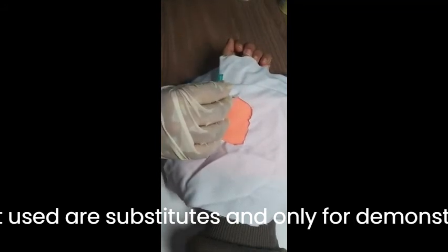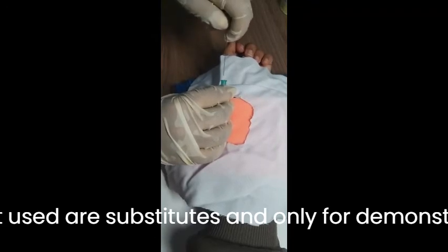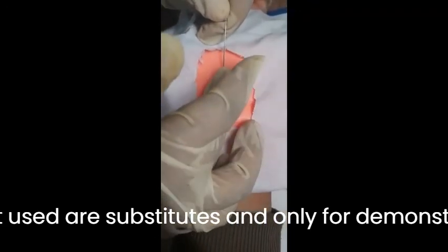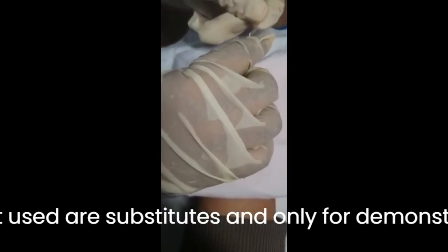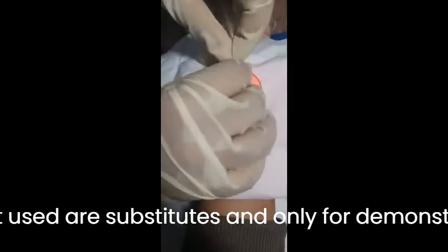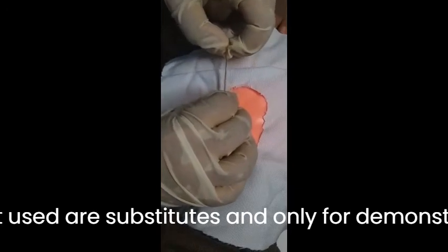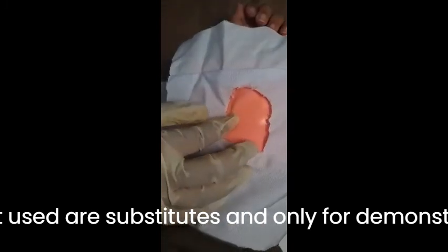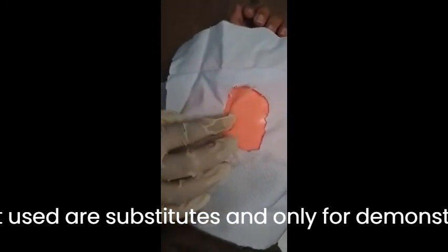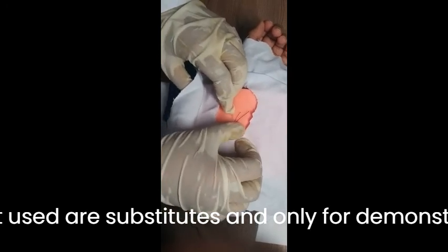After insertion of the needle, insert the guide wire. Once the guide wire is in place, insert the catheter and make sure that it is also in place. After catheter insertion, carefully remove the guide wire. To keep the catheter in place, use a suture. Use gauze to wipe off excess blood. Apply transparent occlusive dressing to the site.